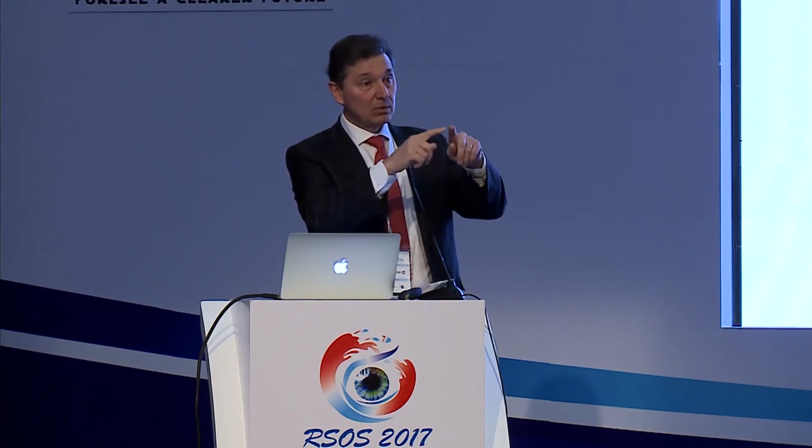I took it out. Schwind have been very careful about the way they've thought through this. They've added a lot to what they're doing. So one of the first things they do, if you do a procedure on a WaveLight that's wavefront optimized, the laser doesn't care if the cornea is 49 or 40. It does the same ablation. On the same laser, if you do it custom Q or you do it topography guided, now the laser does care. It changes the ablation profile to suit not only the Ks, but also the asphericity. So it really customizes it.